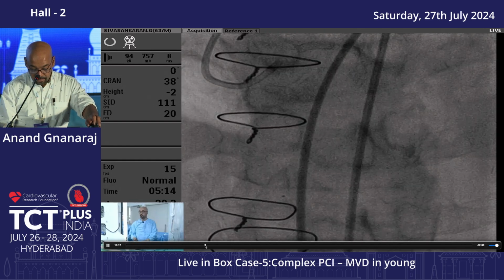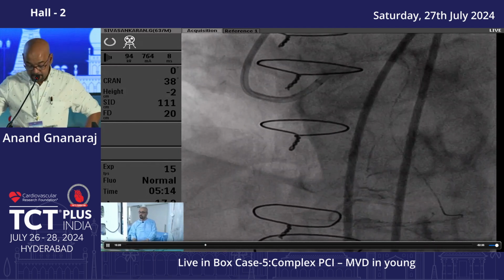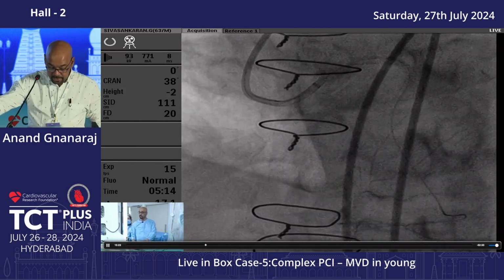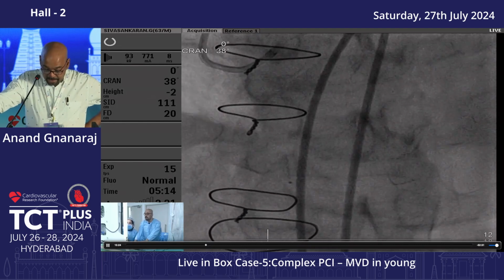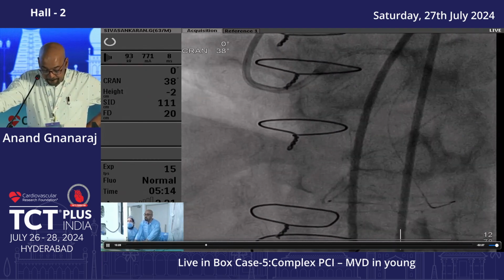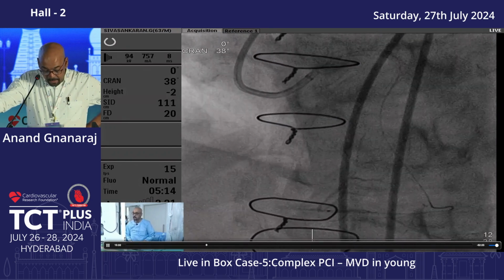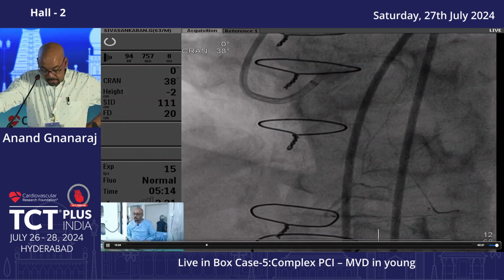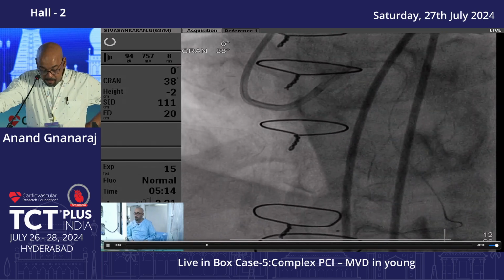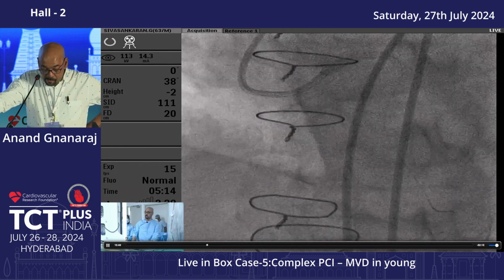Madam, if you think... So I took an injection in the microcatheter to see the distal cap. A PLV or... pressure is going down. You have to pull out.